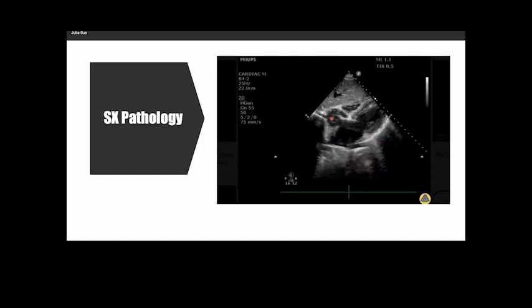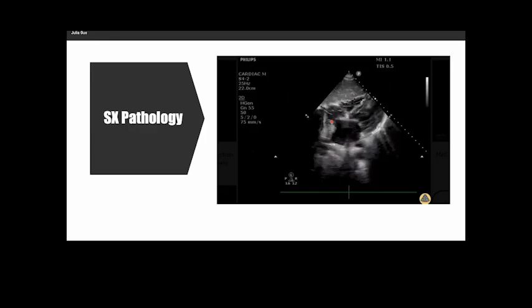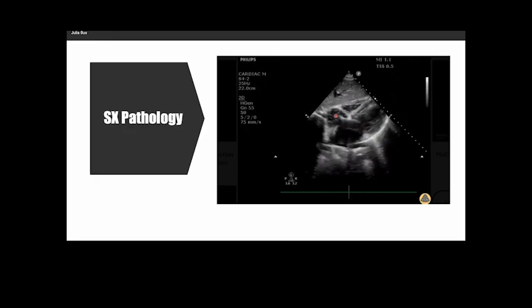And then you might ask, what are all these like twinkling stuff in the right ventricle? That's actually probably agitated saline. So if patient has IV going, you're gonna see this in the right ventricle. Whether or not this patient's alive or dead, you're gonna see some gas bubbles in there. It's probably from the IV. Okay.